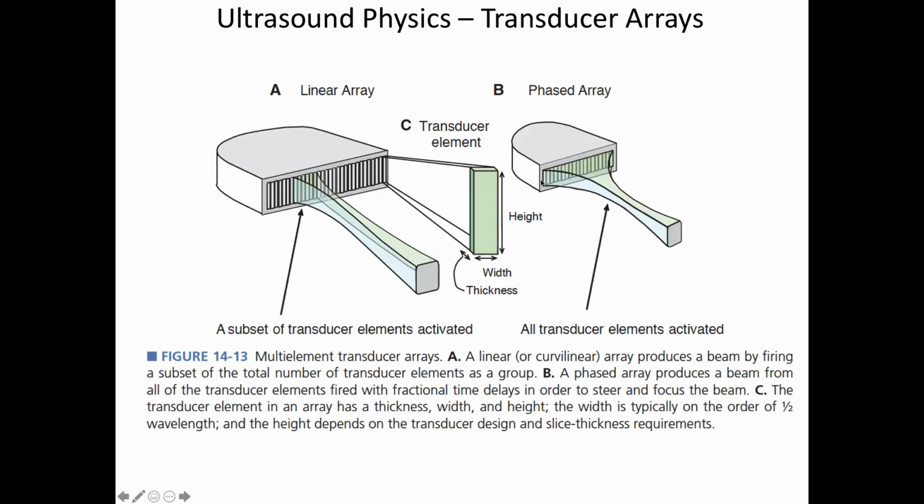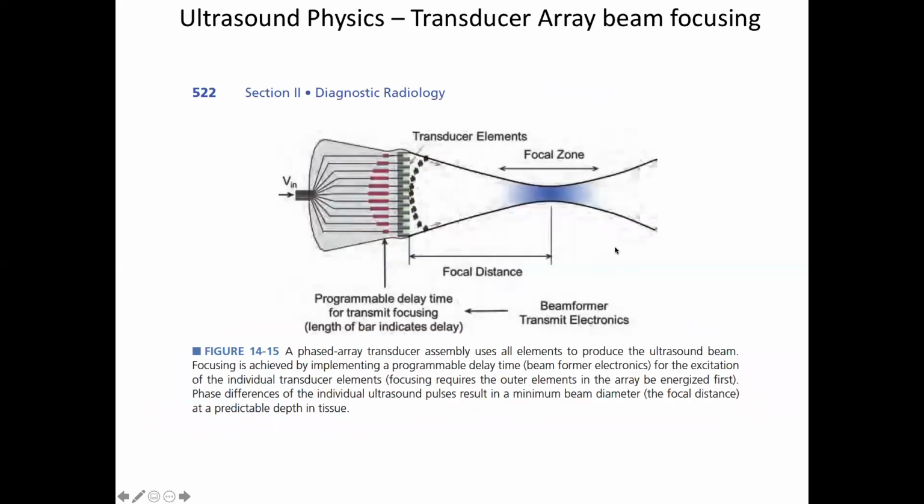So if I start the crystals out here and out here slightly earlier in their pushing in than the crystals in the middle, you can imagine I'm going to get a focus of the pressure wave, because from each crystal you would have sort of a circular pressure wave coming out. And then when you add them all up, that's the wavefront that you see. And so we'll phase the pressure waves of these such that we produce a focused beam, and we can choose where that is.